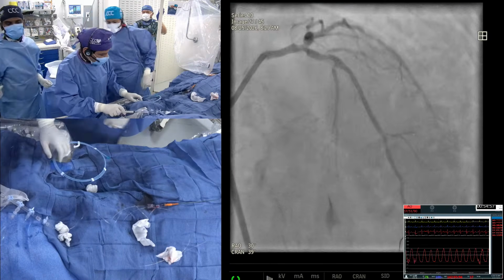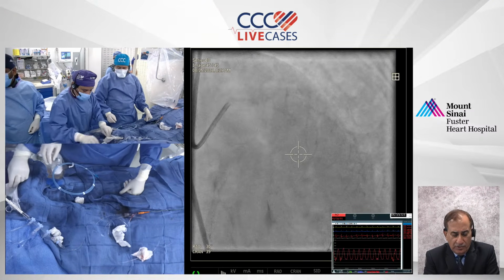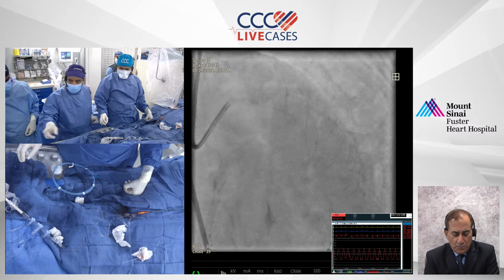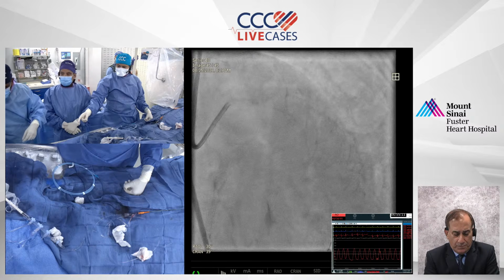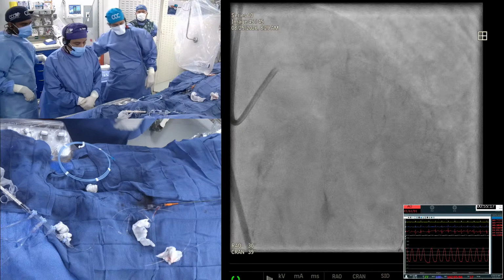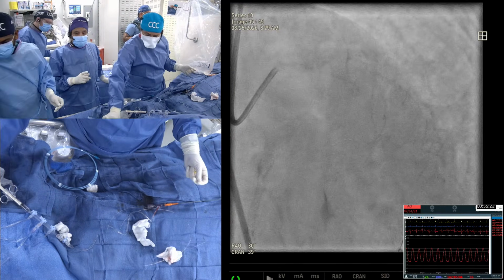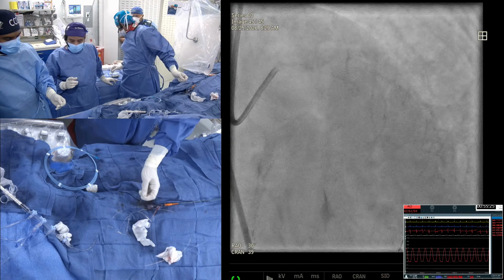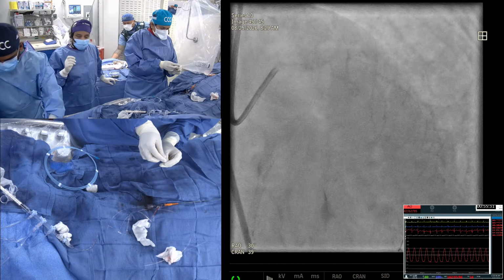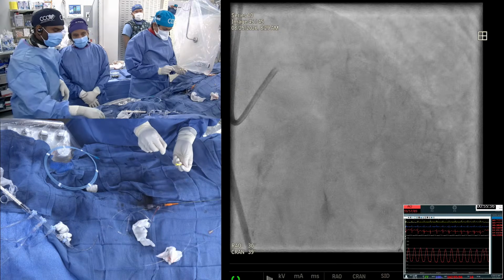So here is a very unusual second part question. I'm going to read it as it is sent to me. How to change the speed inside the vessel? Oh, this is the dial up from outside. We can use that from the dial. You have to have the tachometer, and then you can increase the speed. Now, I say a different point: if you're thinking that you are going to increase the speed, that is not the right thing, because you want to see what is the deceleration, because deceleration tells you how tough the plaque is, how much slow flow or debris will be generated, and anything more than 5,000 is the limit.